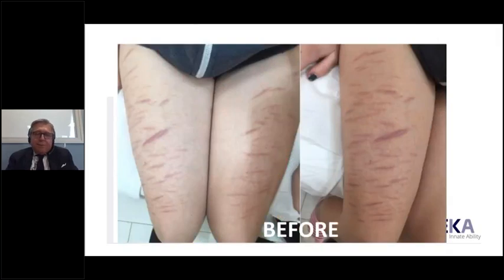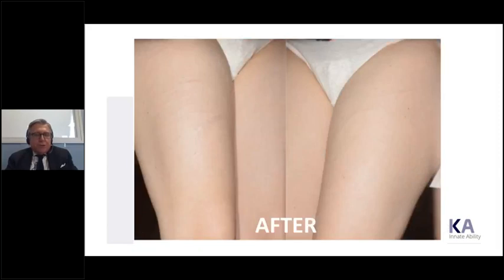There are self-inflicted lesions with the following bad scarring, red scarring, sometimes with a very thick, fibrotic lesion. Before the treatment, we combined pulse dye laser, Vascu from DEKA, and fractional CO2, SmartXide 2. And you see after the first procedure with the pulse dye laser, 1 month apart, a second treatment with the fractional CO2, and then the results.